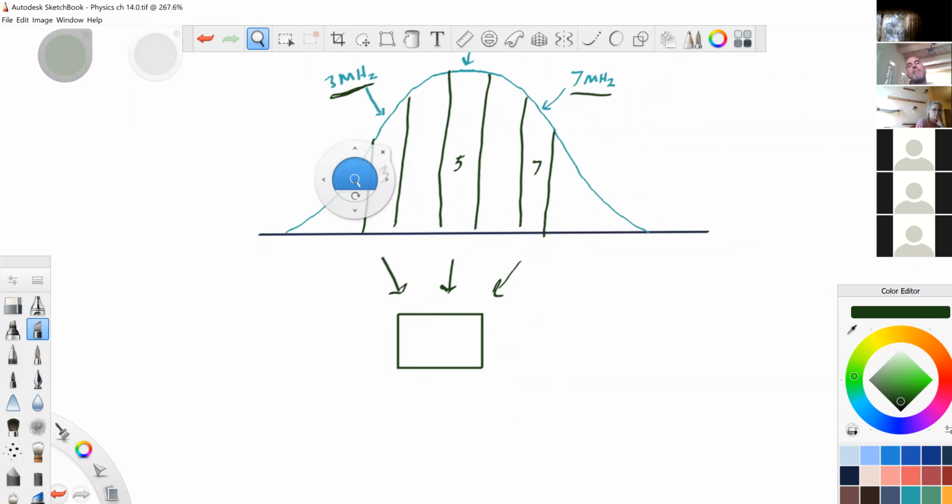Now, why would we bother with this? Without dynamic frequency tuning, we're already using 3, 5, and 7. We're just kind of mixing them all together and calling it a day. But now we're separating them out, processing them separately, creating little imaginary pictures separately, and then bam, putting them all back together and creating the actual picture with 3 separate sets of data.